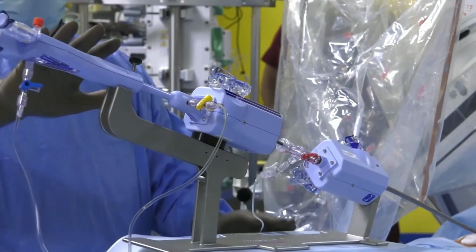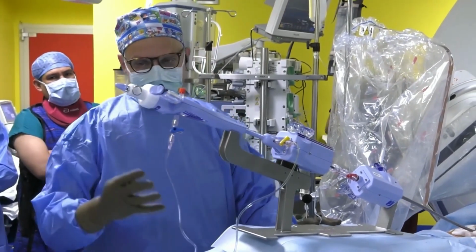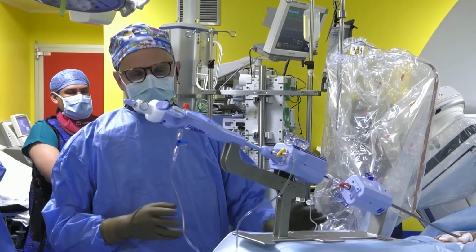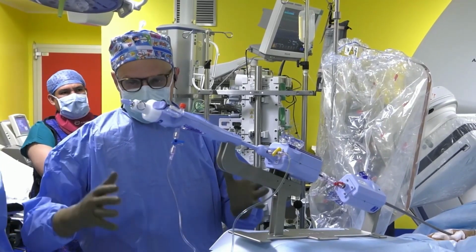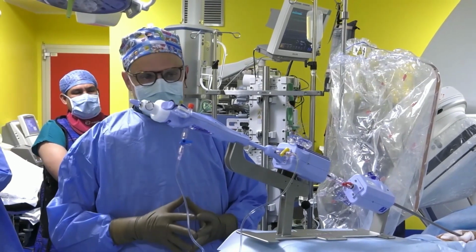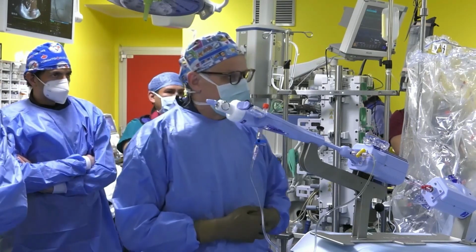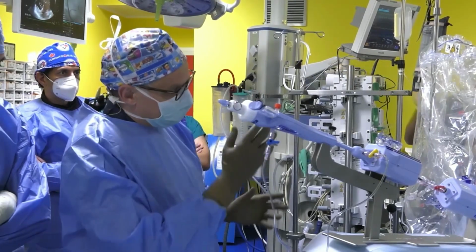On top of that, we are using a G4 clip, Generation 4, meaning that we have four sizes: XT, XT wide, NT, NT wide, and independent grasping, which are really making this procedure more straightforward, a little bit more standardized, more controllable, and in our practice now it has become very controlled. I would like to ask Eustachio Agricola to show us some images of this particular patient, starting with a transgastric view. Eustachio?